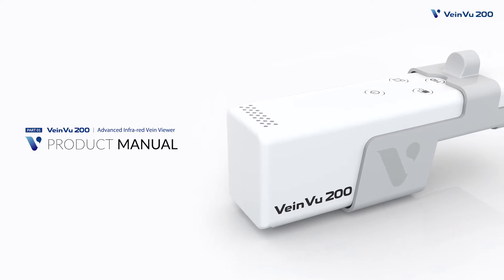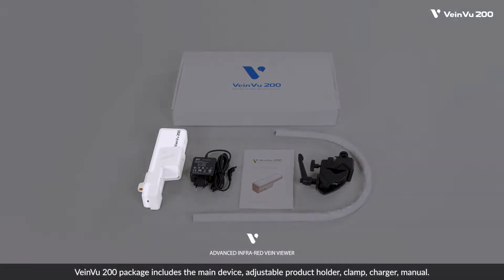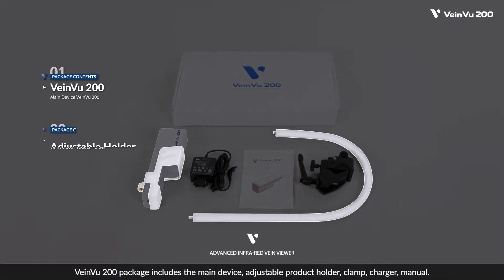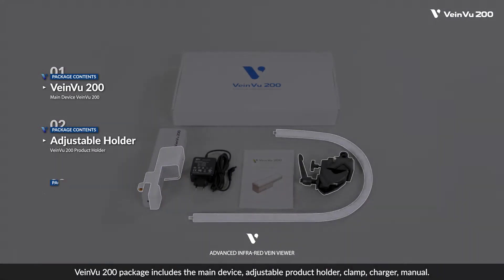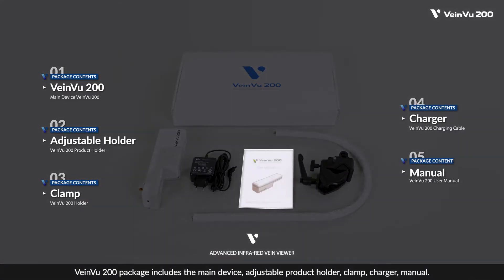Product Manual. The VainView 200 package includes the main device, adjustable product holder, clamp, charger, and manual.